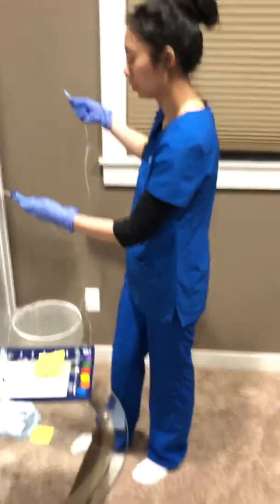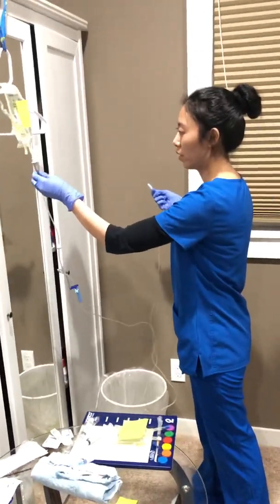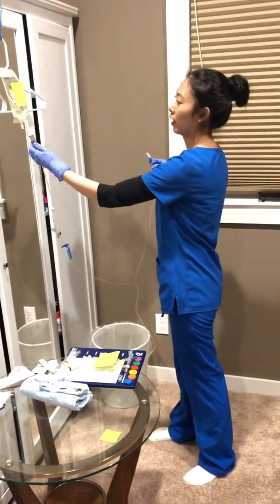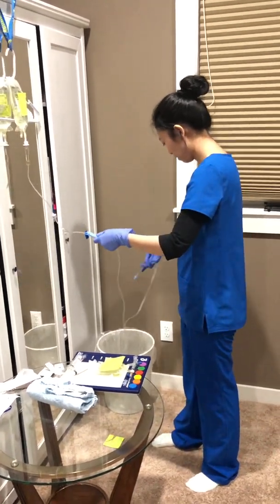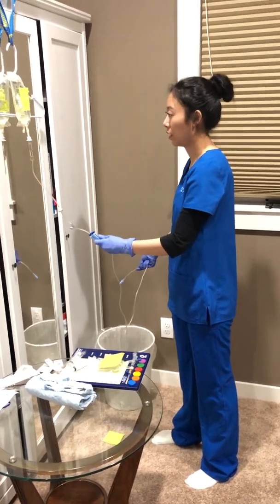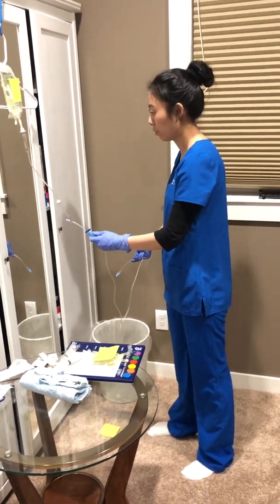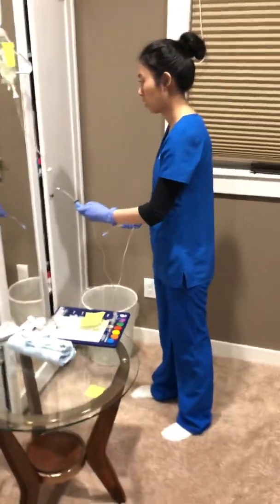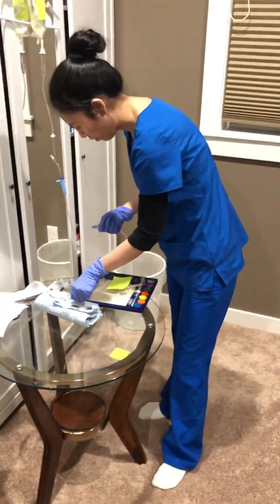Then I'm going to unclamp it, squeeze the chamber, like halfway. And I open the clamp. Make sure there's no air bubble. Okay, clamp it. So this one is already clean.